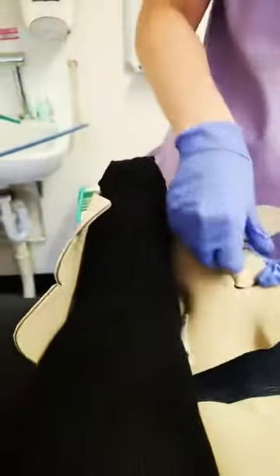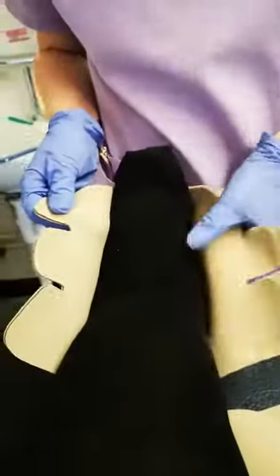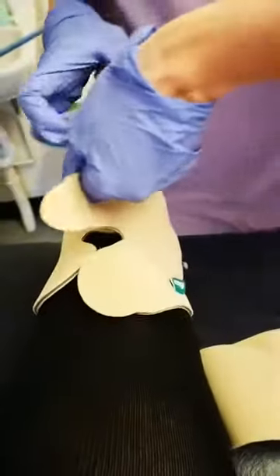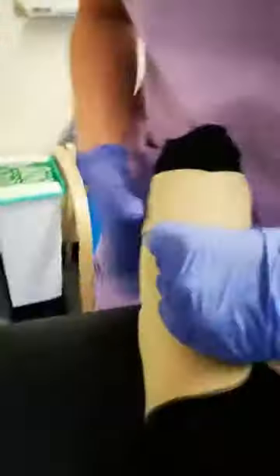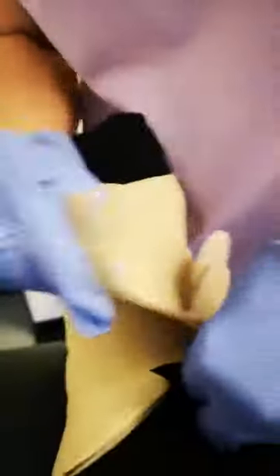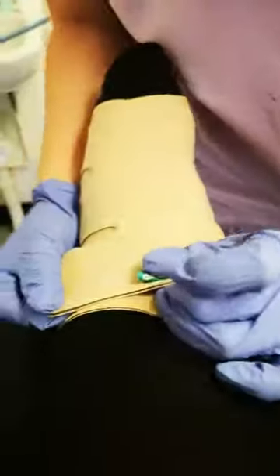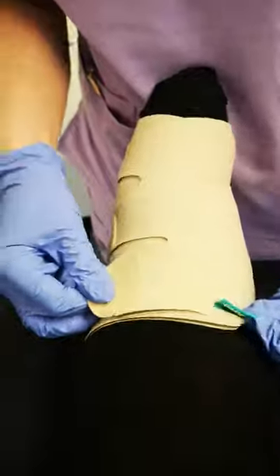We're going to strap this on as tight as we can. Got a strap on here. Pull it as tight as we can get, and across as tight as we can. If that's too tight, we can release it — that's the good thing about this. We've got an extra bit here.